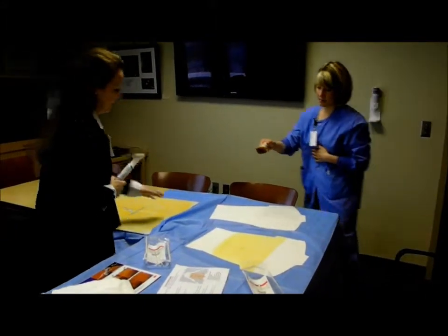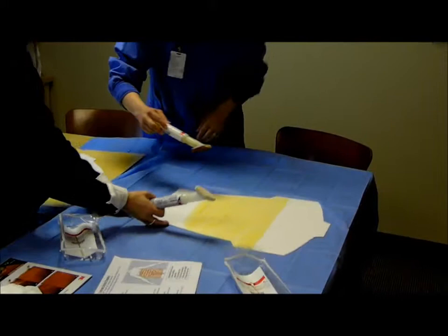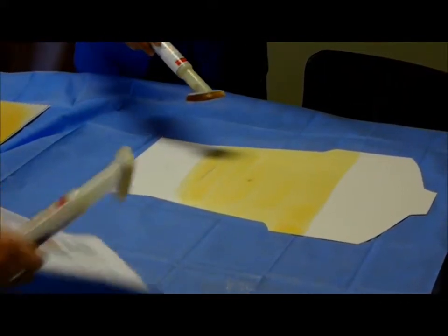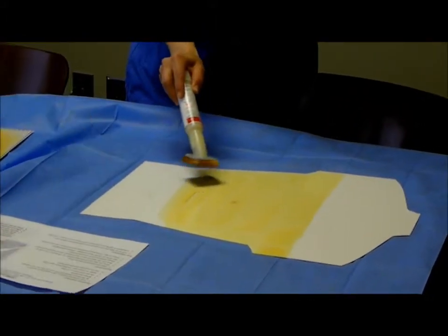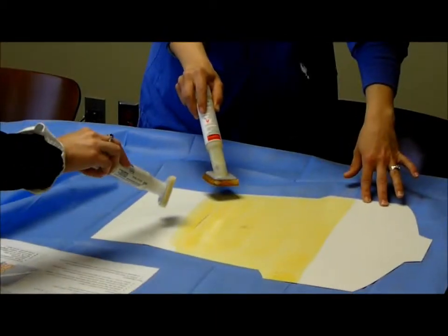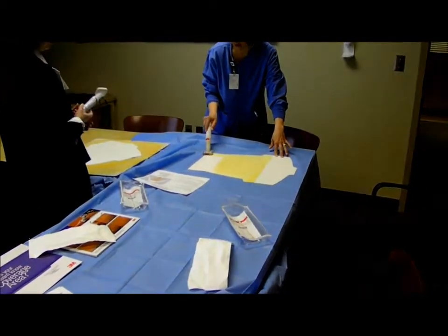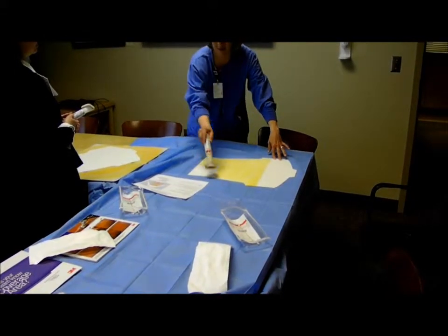Okay. Right. And then I would come down here and then do the thighs. Just kind of like this. Should I start from the outside and go in or in? It's going to depend on the anatomy, but basically you want to end up in the dirty area. Consider the dirty area last. Okay. So really it's just painting it nice and even. Exactly.